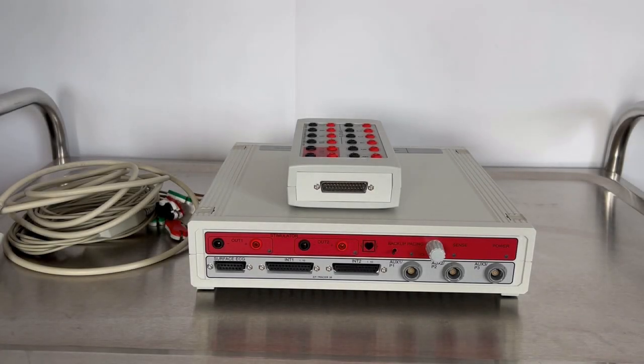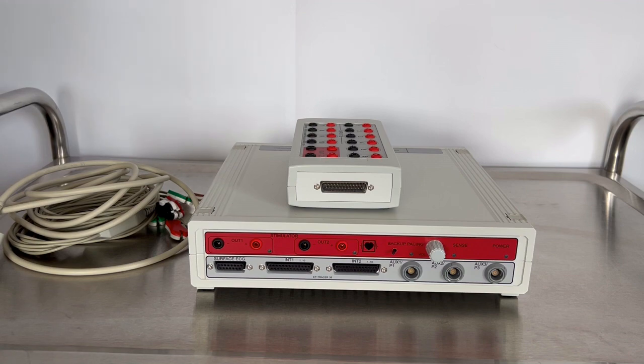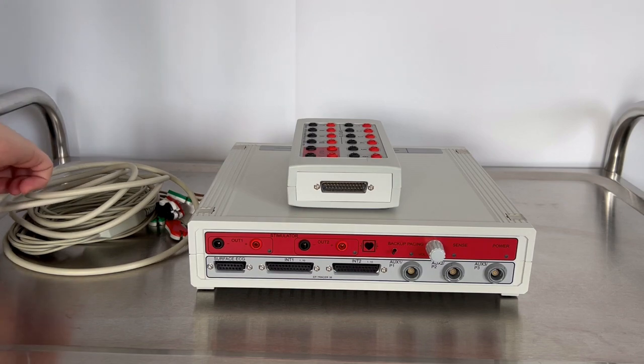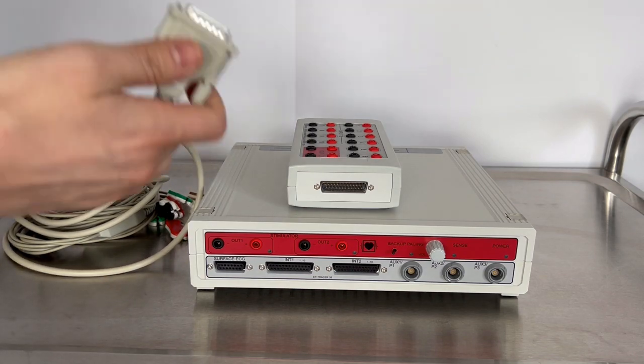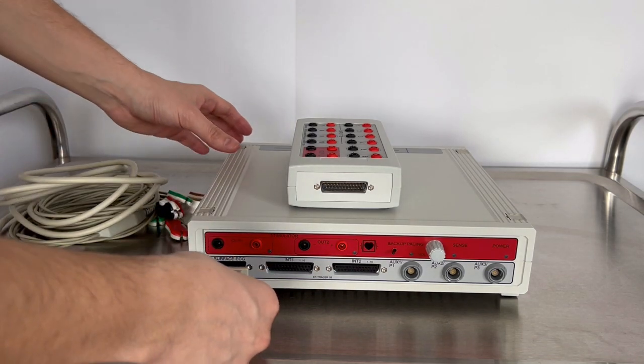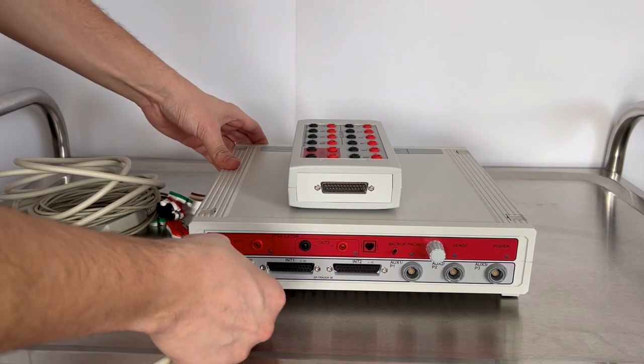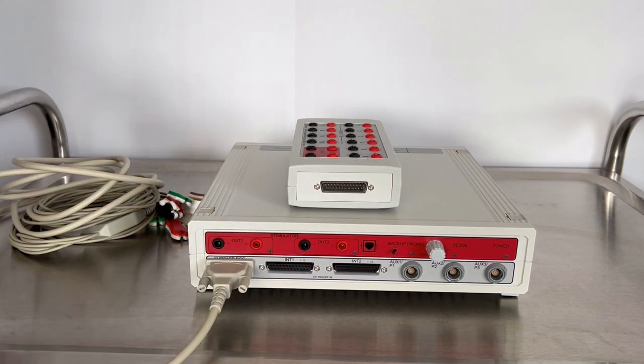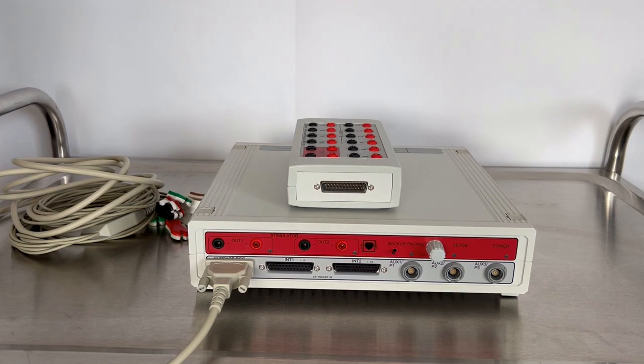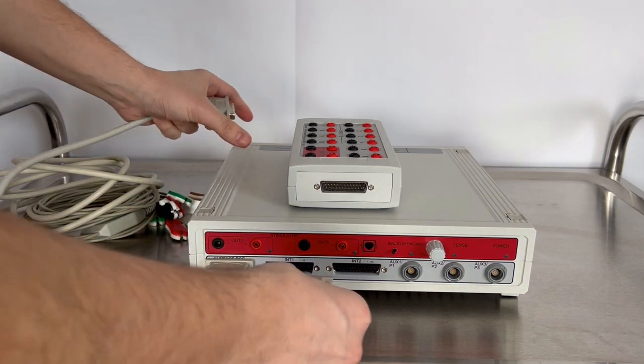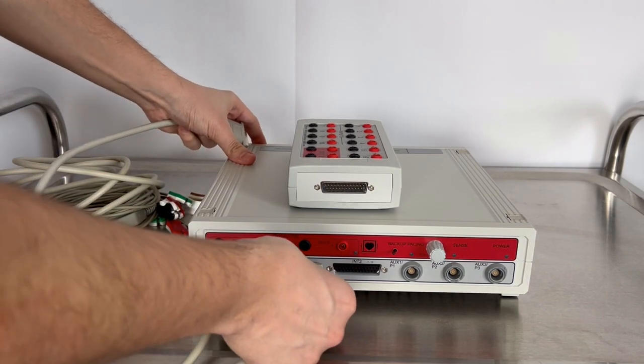On the front panel of the amplifier, you'll notice multiple connections, with the most pertinent ones being the interface for the surface ECG cable and the connection point for the connection boxes, also referred to as CCB boxes.